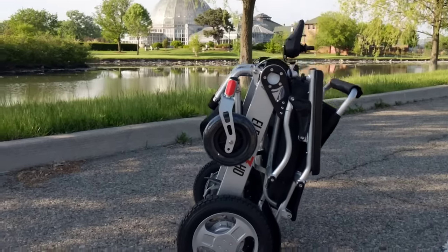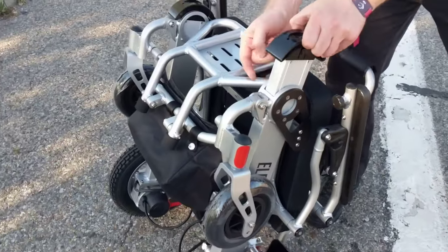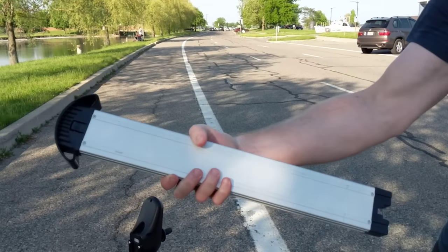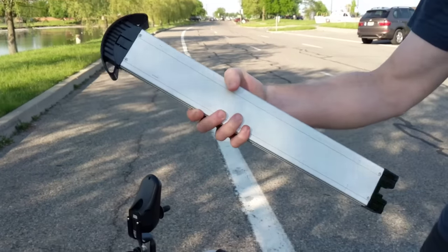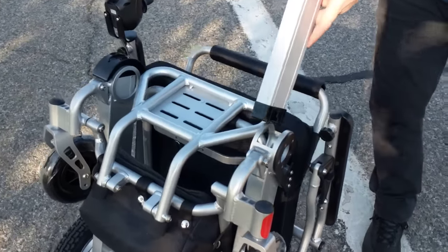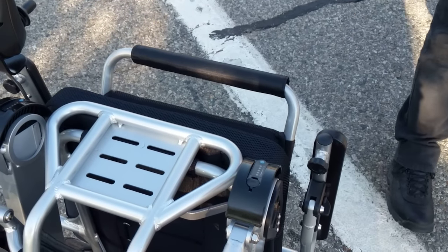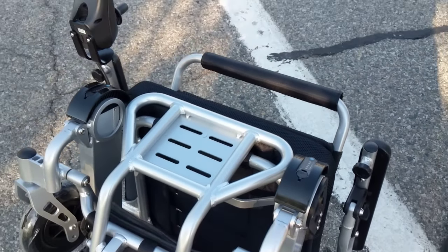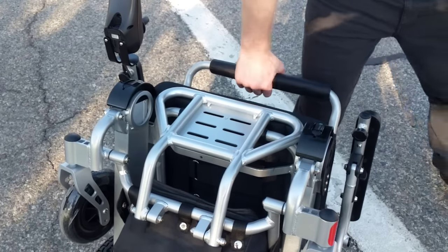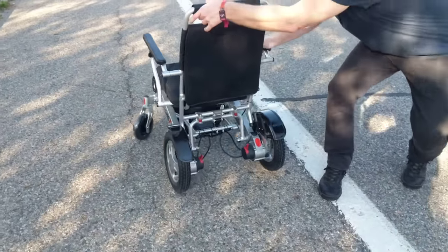This chair comes with two batteries — two chargeable lithium ion batteries, very easy to remove, four pounds apiece, airline friendly, FDA travel approved batteries. They fit right into the arms or support mechanism of the chair, so you don't have to bend over and get the batteries from behind the chair, which is very common in some of the other chairs.